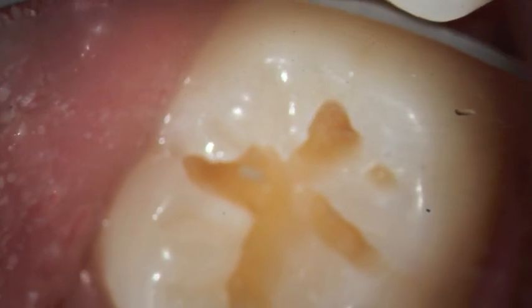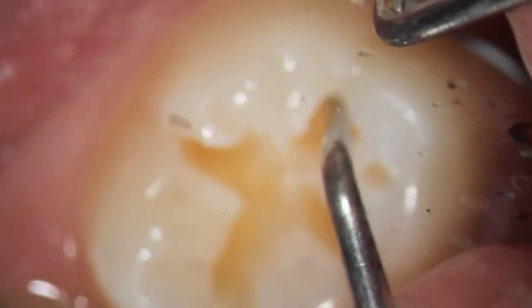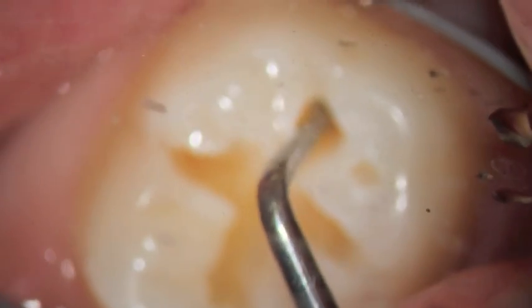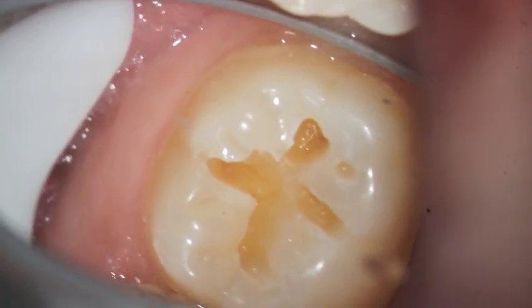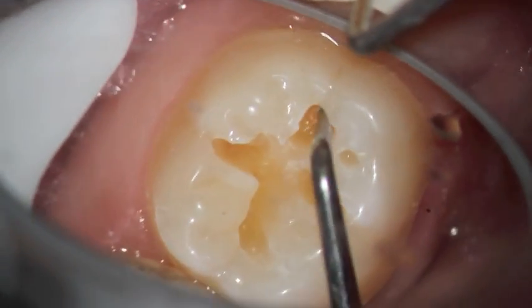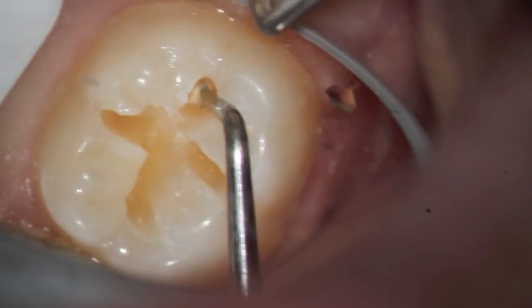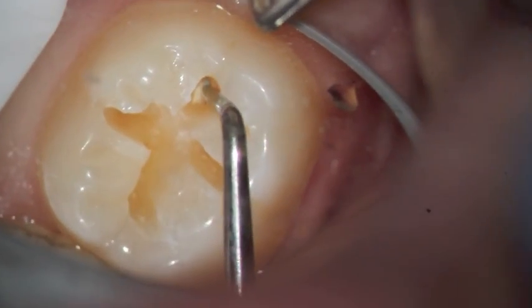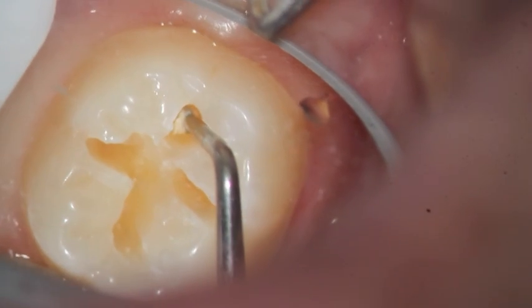And we go in and test it. And anything that's soft, we know for sure that that's decay. Teeth are supposed to be hard, not soft. And you can see it peeling away. And that's much larger than the little brown stain that we saw from the beginning.